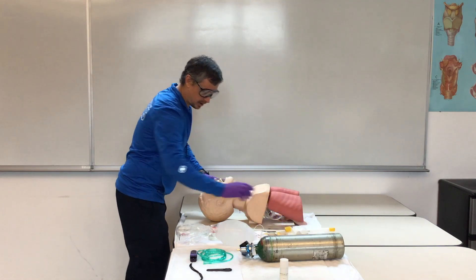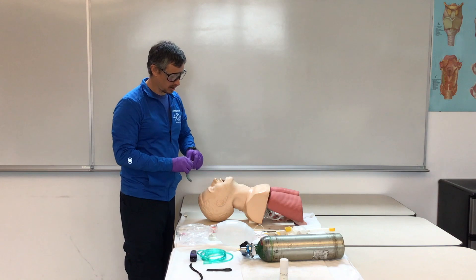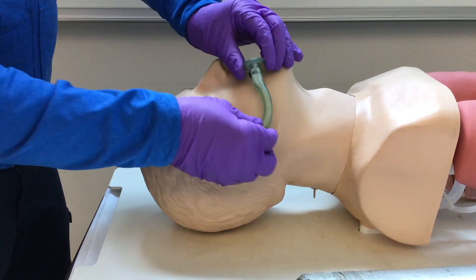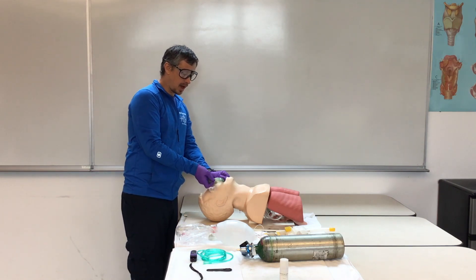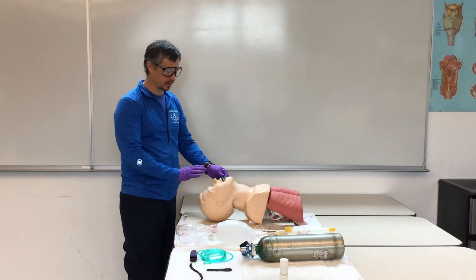Once we have that airway clear, we're going to take our oral adjunct, just like our OPA station. Measure from the corner of the mouth to the corner of the ear. Open the mouth, insert the OPA upward, and then twist it in so we don't push the tongue posteriorly.